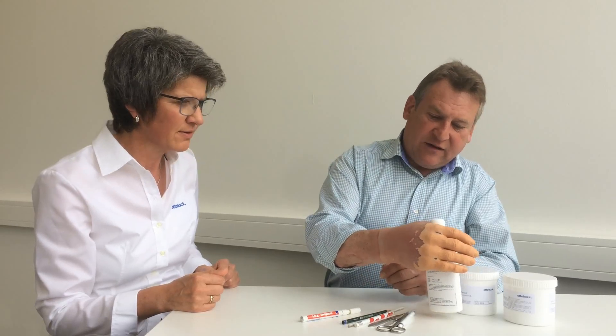Please try gripping the bottle. I can grip the bottle, but it slips out of my hand a bit.